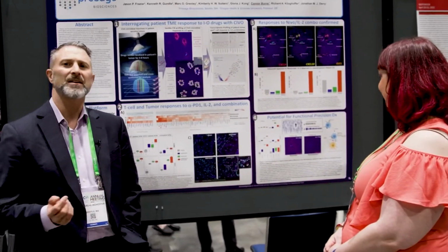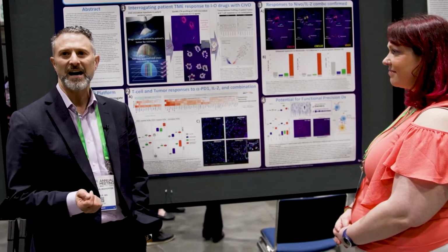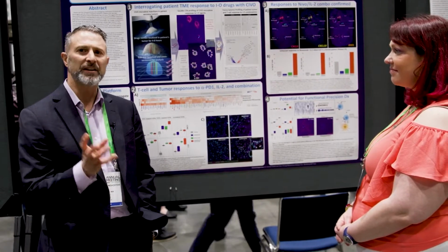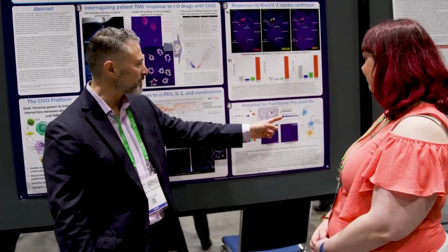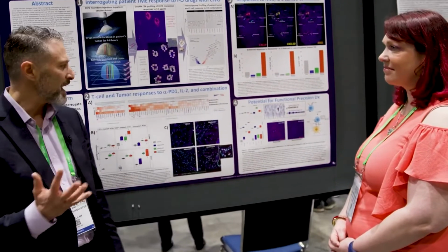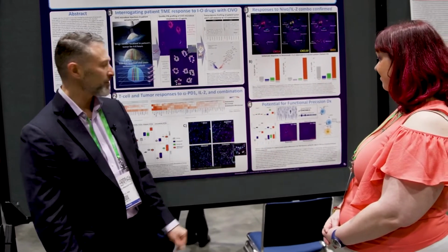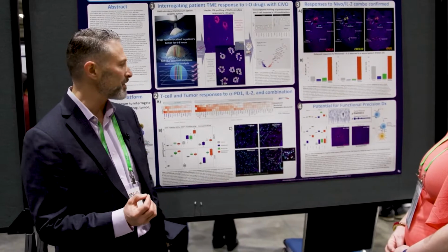And ultimately, we see a very intuitive utility of the technology as a functional precision diagnostic, or a diagnostic for drugs that have no clear genomic biomarker of response, so we can start teasing out exceptional responders versus non-responders. And we're already seeing evidence of this when we compare different patients using the signals, or the signatures, from the Nanostring platform.